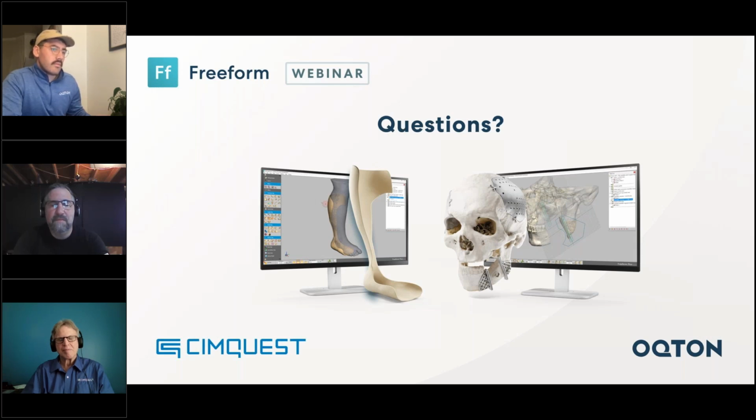It's got a complete tool set for doing that, very comprehensive. Plus, it's also got some very unique things to speed up segmentation of bone, vasculature, for example. And then it also goes into deep learning. So we've got some deep learning solutions especially for CMF at the moment, and then spine and a few other things as well. But you can just generally think of it as very professional grade.